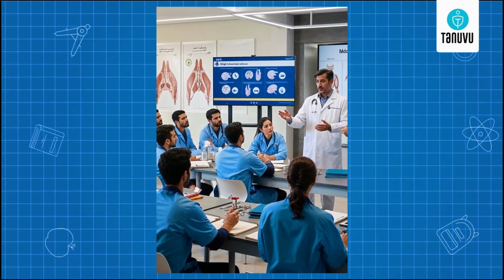ECG is often a point of fun for the examiners and a nightmare for the students. It's an ancillary topic, it doesn't come under the main topics of medicine. So it has to be studied thoroughly and effectively to understand and clear the viva with flying colors. So let's dive deeper into it.